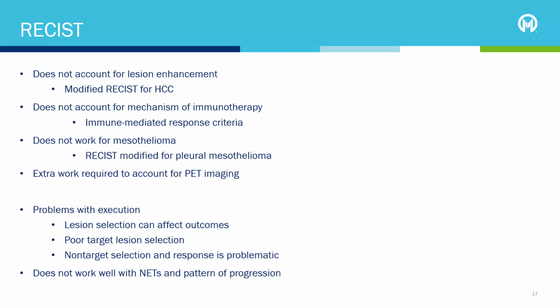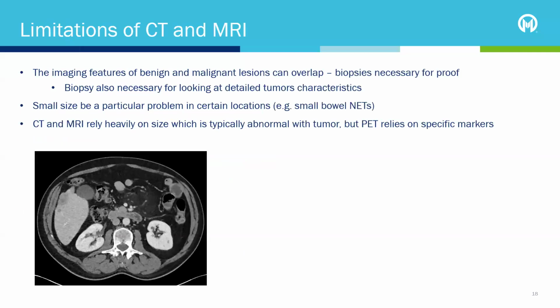because you can say things in a report that then can get picked up on and utilized inappropriately. So sometimes those scans are a little more vague in their impression. It may just refer to the target and non-target lesions. So that's another problem: the language can be very formalized, and if you use it inappropriately, sometimes that can result in problems. So to sum up, it works well for clinical trials, but you don't want to use it day-to-day. That would be horrible.